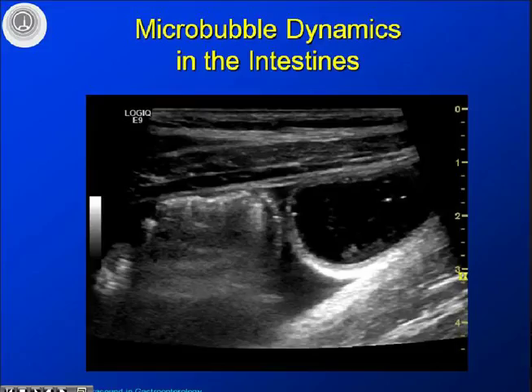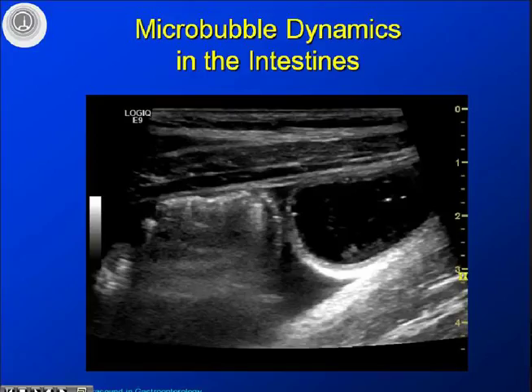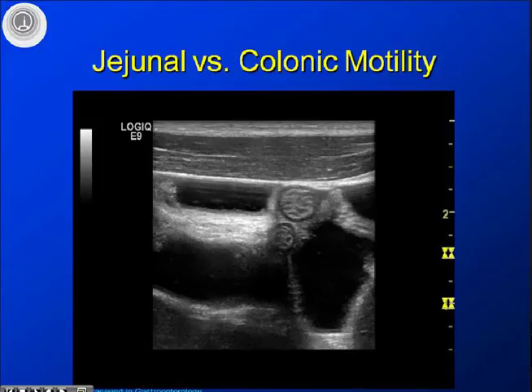Microbubble dynamics — there are actually a lot of microbubbles within the GI wall, as many of you have observed. You don't always need to inject microbubbles; these are natural microbubbles in a jejunal part of the abdomen alongside a more stationary colonic part. This air layer within the intestines actually helps you delineate your measurements more precisely. This shows the difference between colonic and jejunal activity: the colon moves more slowly than the jejunal loops in a normal situation.